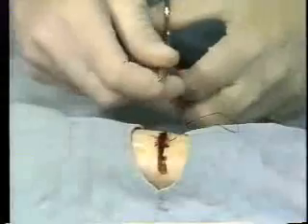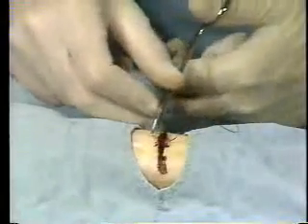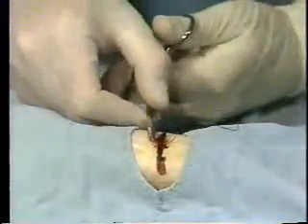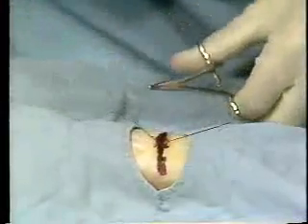Release the needle holder and grasp the needle near the point with the holder. Draw the suture through both sides of the incision until 2 centimeters of the free end remain, and release the needle holder. Hold the end of the suture that has the swage needle in the non-tying hand.